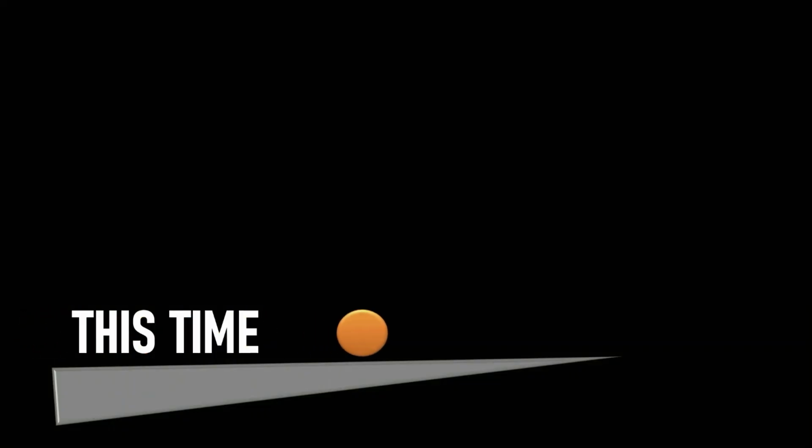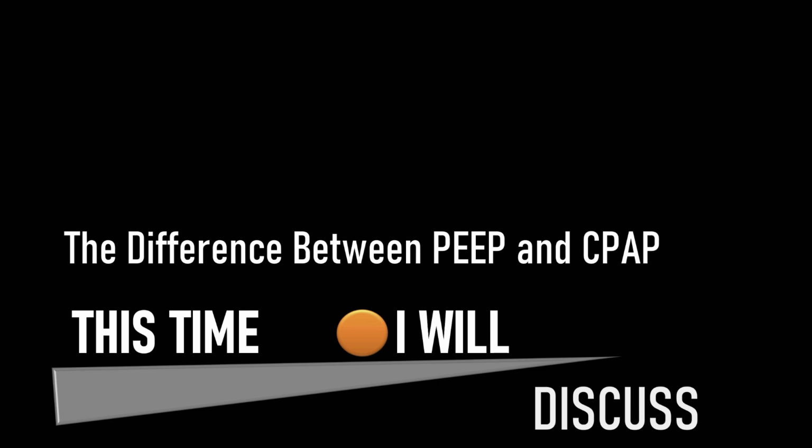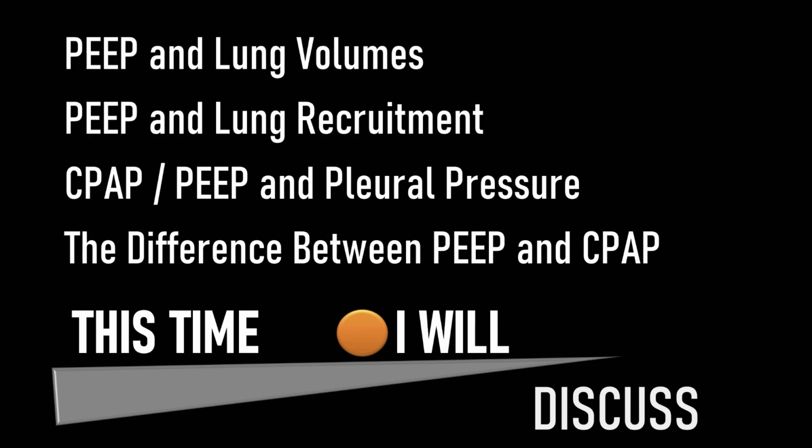This time I will discuss how to restore functional residual capacity, and this can be achieved using either positive end expiratory pressure as part of a positive pressure ventilation strategy, or using CPAP, continuous positive airway pressure, where that is the only form of respiratory support. And I'll explain the difference between PEEP and CPAP. I'll also talk about PEEP or CPAP and pleural pressure, PEEP and lung recruitment, and PEEP and lung volumes.